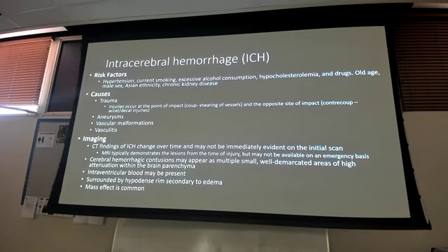The sub-bullet underneath the first one talks about MRIs demonstrating lesions from time of injury. Yes, MRIs can be better at finding small bleeds. MRIs can also be better at finding TIAs or mini strokes. But if it's that small where it doesn't show up on CT, is it emergent? Probably not, right? You can't get an MRI on an emergency basis. And that MRI is still a 45-minute scan, whereas with this CT, they're going to be in and out in 30 seconds. The scan's that quick.